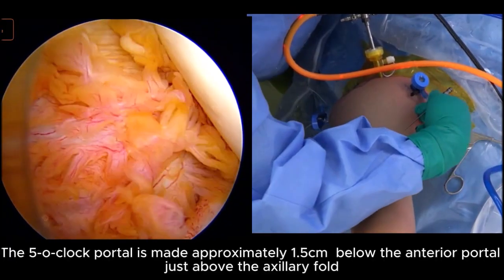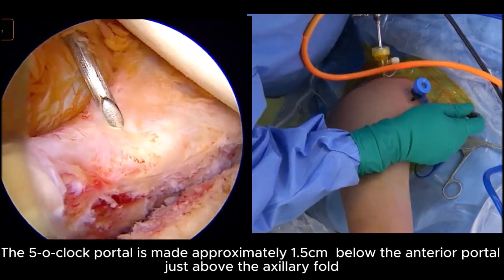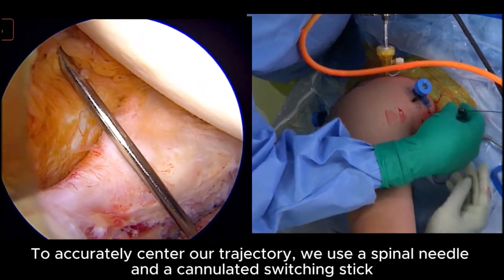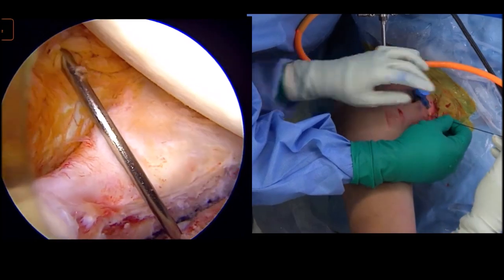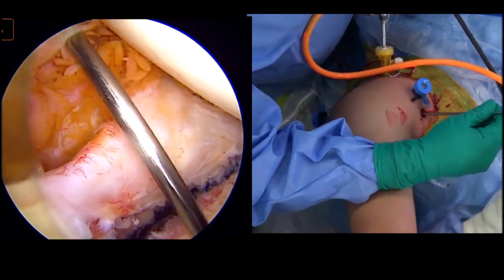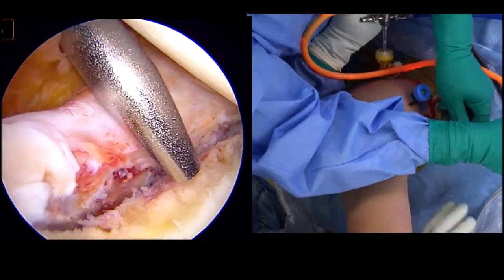The 5 o'clock portal is made approximately 1.5 cm below the anterior portal, just above the axillary fold. To accurately center our trajectory, we use a spinal needle and a cannulated switching stick. This can directly access the 5 o'clock face of the glenoid and can often be safely placed through the subscapularis tendon.